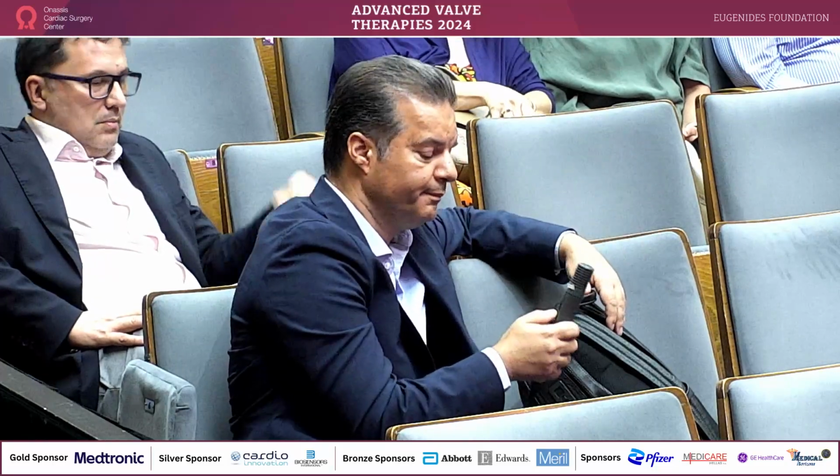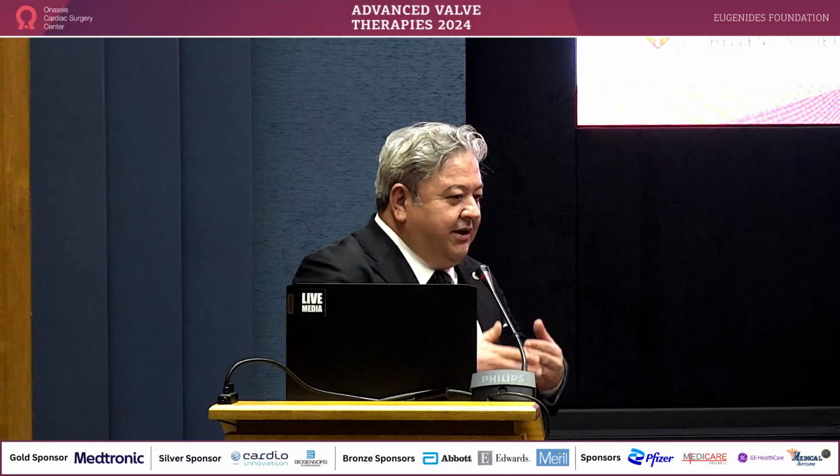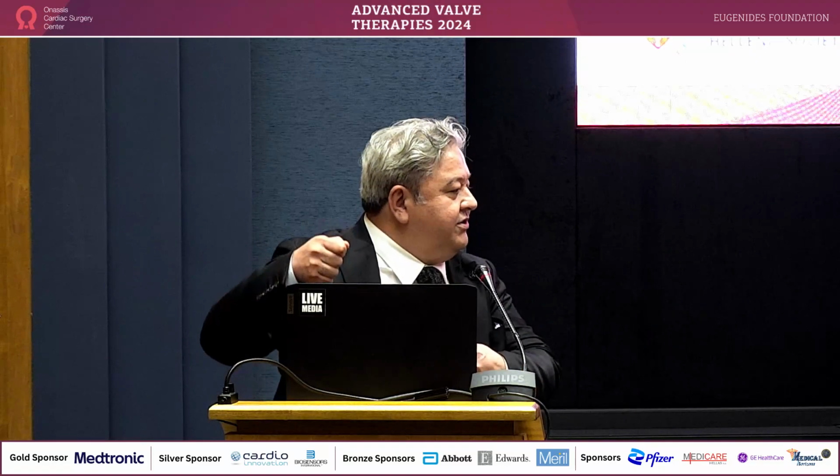Otherwise, it's very difficult. I agree totally with you. Sometimes I manage to succeed just by putting the wire all the way down without actually looping it. So this can also help if you do not have the femoral access done and the patient is heparinized. You can always puncture with ultrasound, so you can get the loop. But for a large delivery system, it's much better if you make an arteriovenous wire loop, because before I was thinking the opposite, that I published the approach without a wire loop, but the wire loop really helps you to cross the large delivery sheath inside the leak.